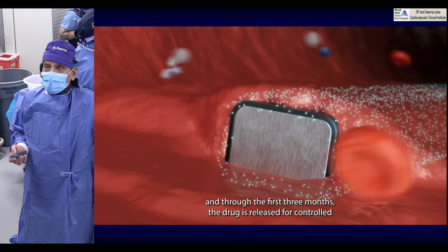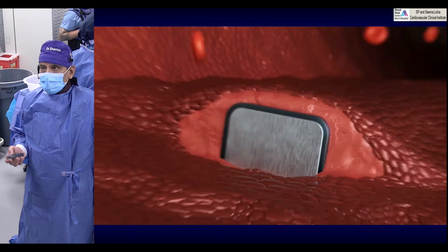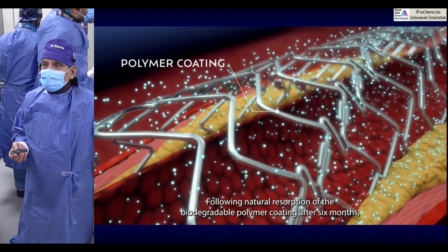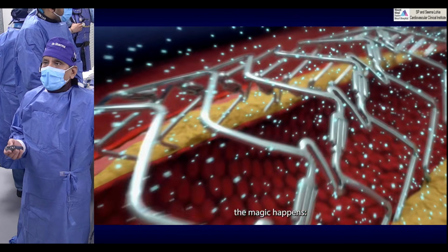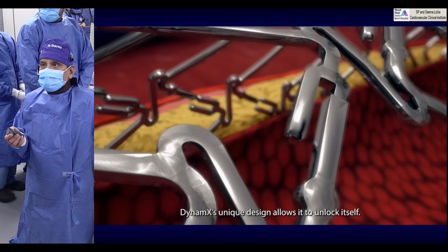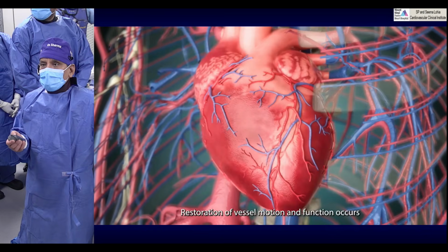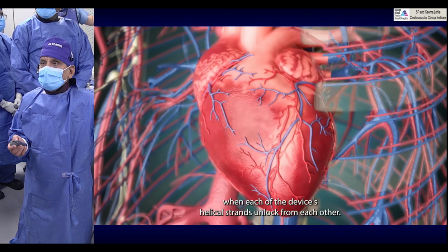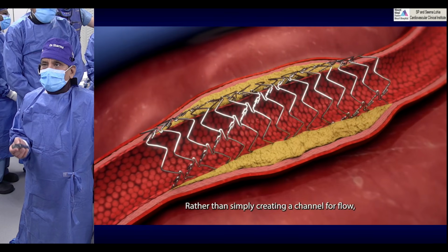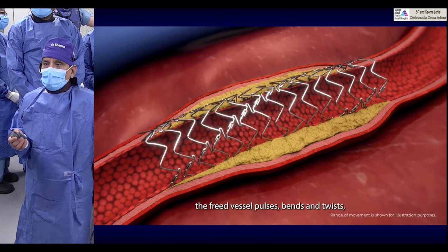Initially, of course, the polymer is there, the drug is released, and the vessel undergoes the healing process. But then after 3 to 6 months, when there is resorption of the biodegradable polymer of the stent, you see what happens. This interlocking mechanism, the stent now can be flexible, no longer rigid. And that restoration of vessel vasoreactivity is the one important identification of this device compared to our stents, which are fixed.